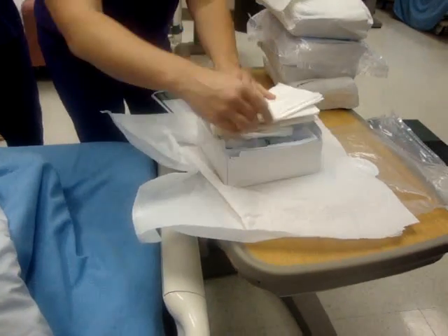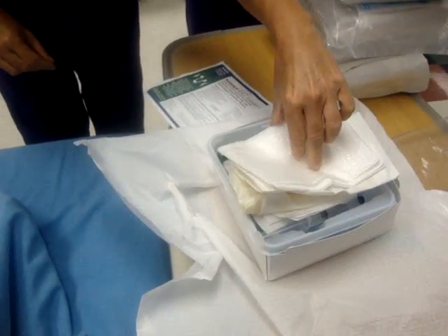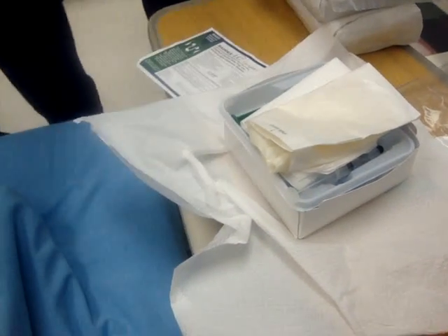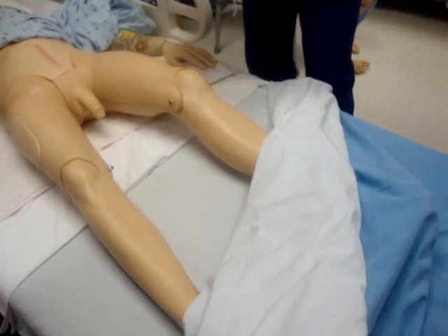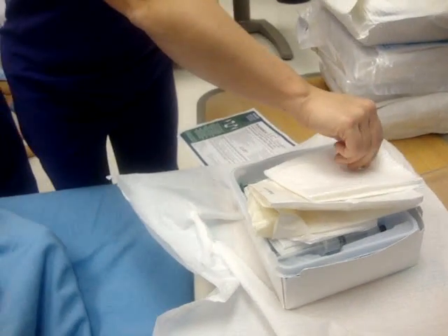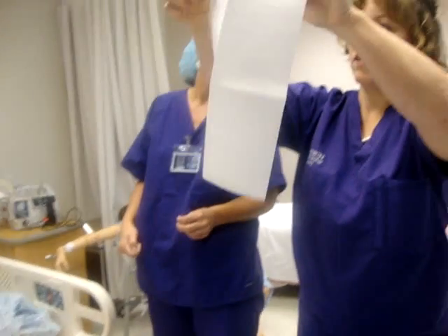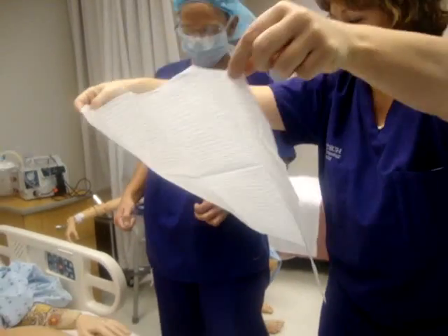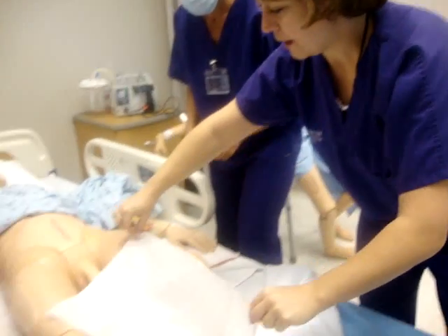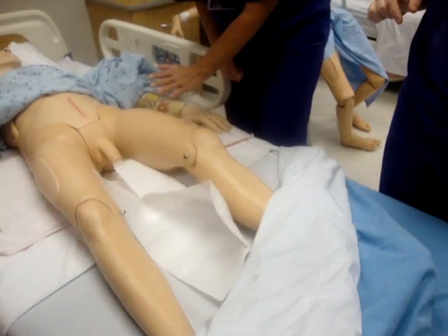What do you do first? Because where are your gloves going to be? They're going to be under this. Okay, I'll see — then we've got to get right at the beginning. Hang on, we're working on it. Just jumping ahead. There you go. All right, here we go. This is not your check-off, by the way, because we'll have a new kit. You have to open it. You don't want to touch all over that — you want to touch this as little as possible. It's right here — you just want to pick it up, kind of find the corners, like this.